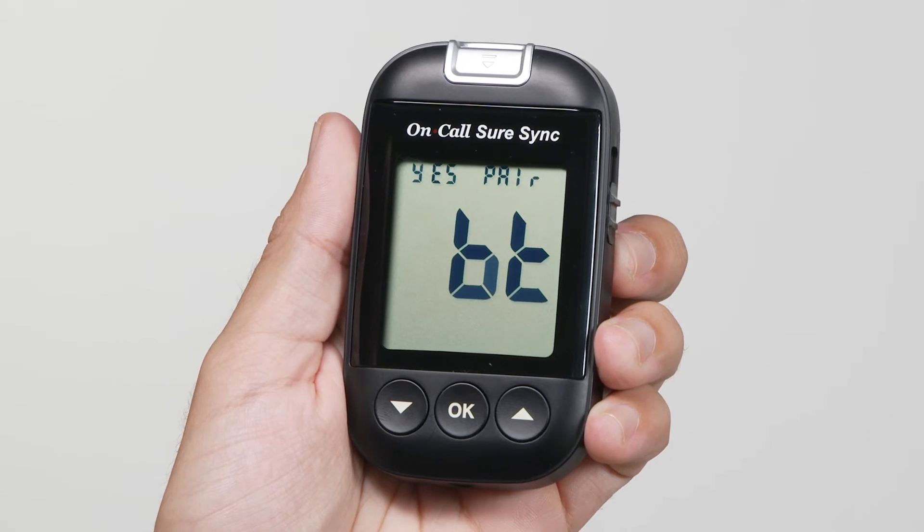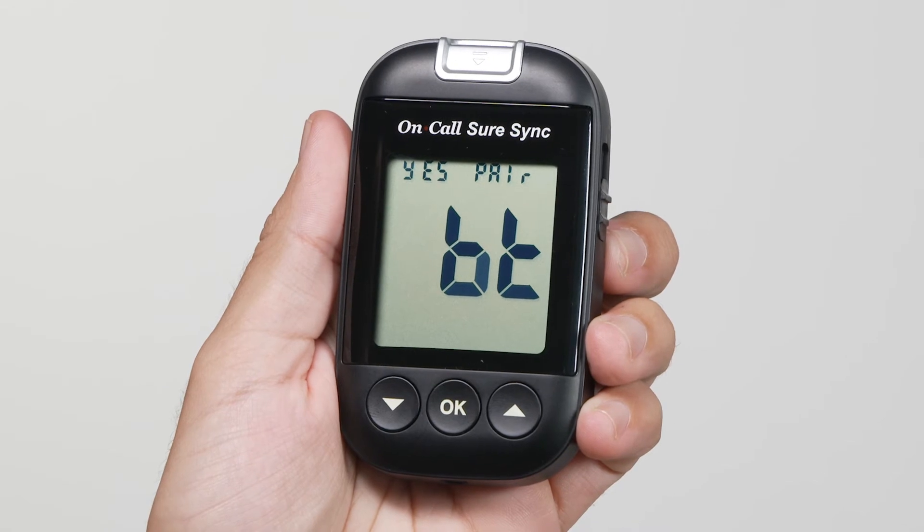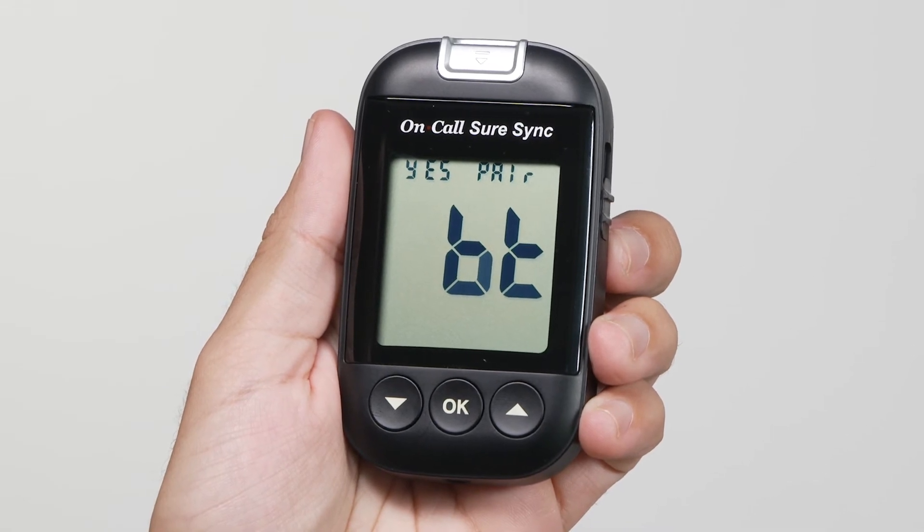Before any data can be sent wirelessly via Bluetooth with either the auto send option or manual Bluetooth transmission, the glucose meter and the mobile device must be paired.